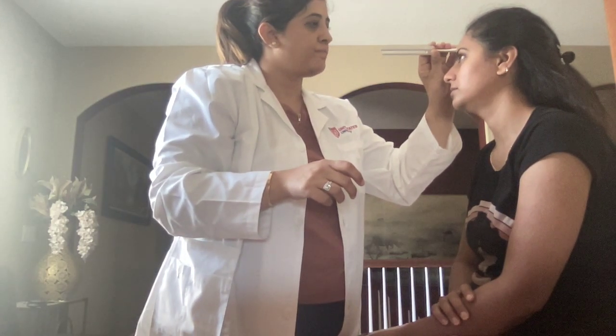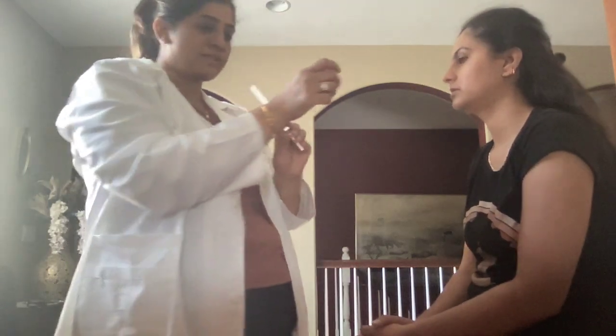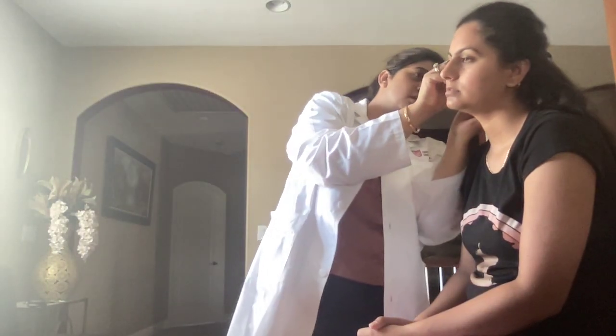I can hear both ears. Both ears. Yes. Okay, alright, now we will be doing the Rinne test. The mastoid bone. Yes, I can hear. Tell me when you don't hear it anymore. Okay. Do you still hear it? Not anymore. Okay. How about now? Yes, I hear it. Okay, alright. The same thing on this side.